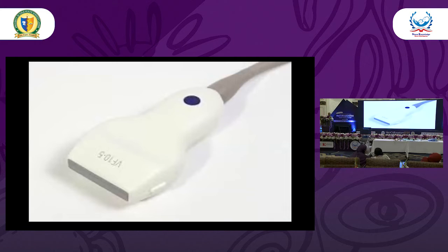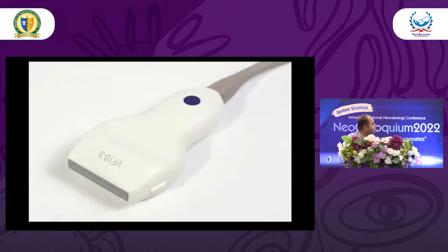This image was included just to show you the basic landmarks, how to hold a probe. This is a landmark which should always be displayed. On every type of probe, any manufacturer, any quality of machine, this mark is present, and it should always be directed towards yourself when you hold a probe. This is another mark which is always present on the probe, and it should be directed cranially, away from you, towards the head of the patient. With this, you can easily hold a probe in an ideal manner.